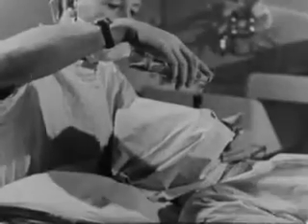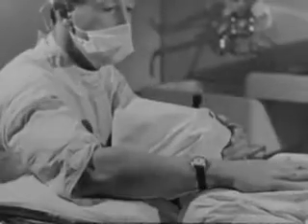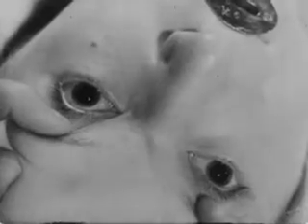This patient is very deeply anesthetized, and the breathing is shallow and jerky. The pupils are widely dilated and do not react to light. This is the 4th stage of anesthesia. If the anesthetic is continued, she will soon stop breathing altogether.